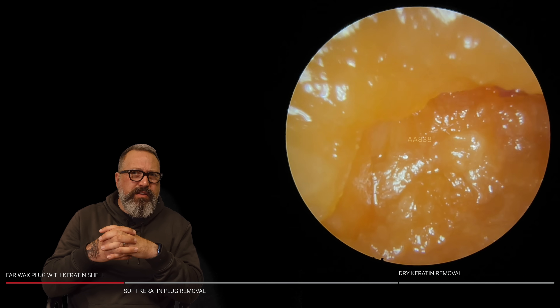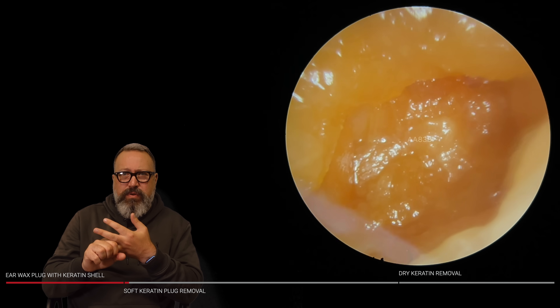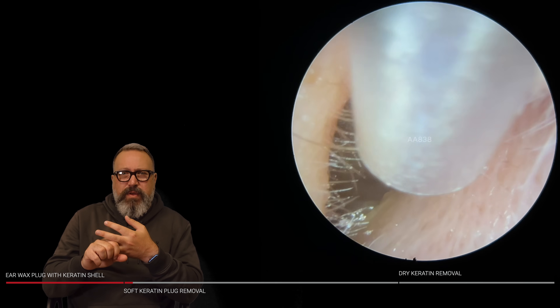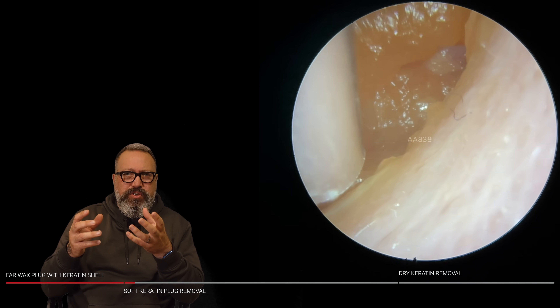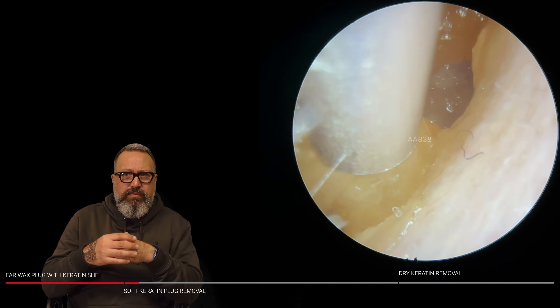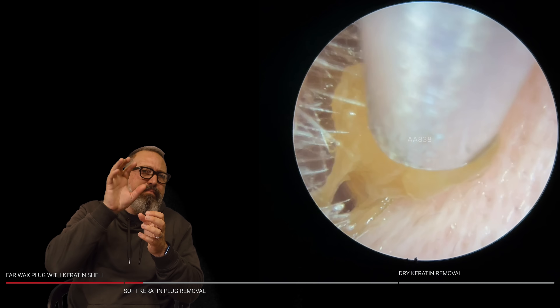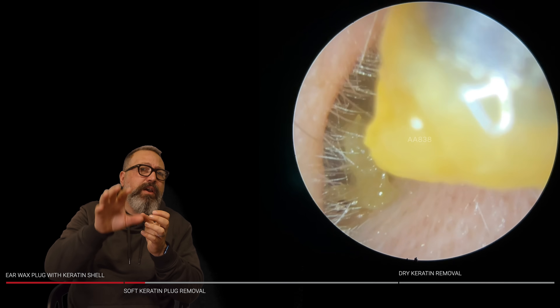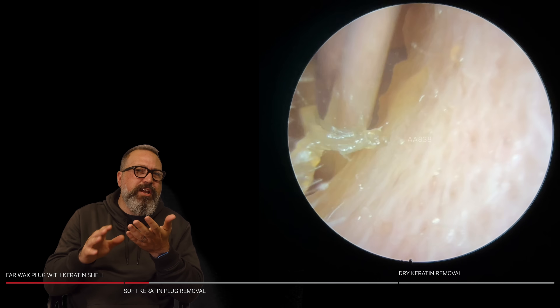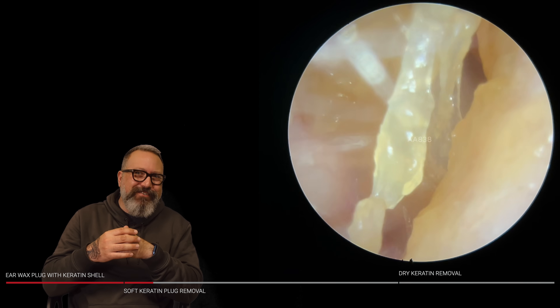Very, very different now. This is either going to be very soft wax or a keratin shell again. We're not going to know until we start to suction this up. This might be a little bit of dead skin — that keratin material that's been softened with a bit of olive oil. I would say that's more likely than soft wax, because if it was soft wax it would have just imploded straight into the suction tube. It would have been like suctioning up thick milkshake. Always aim to spoil as many foodstuffs as we can during the video — I don't like milkshakes, so it's fine.